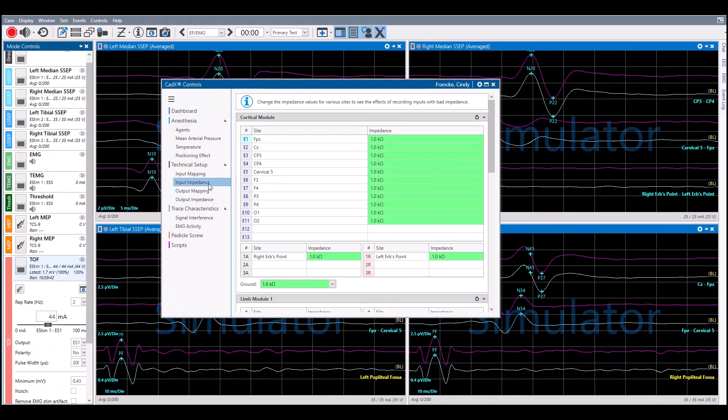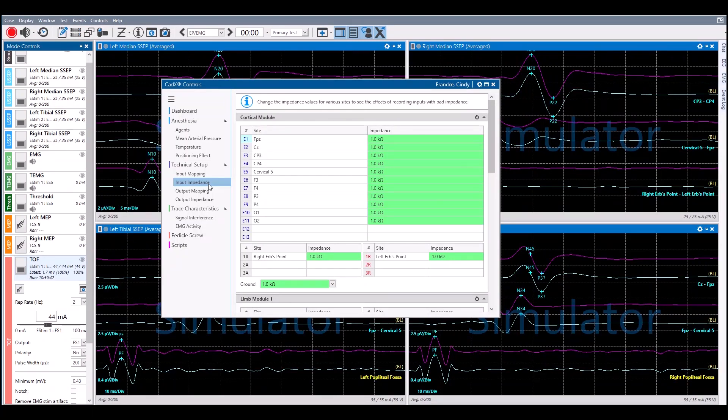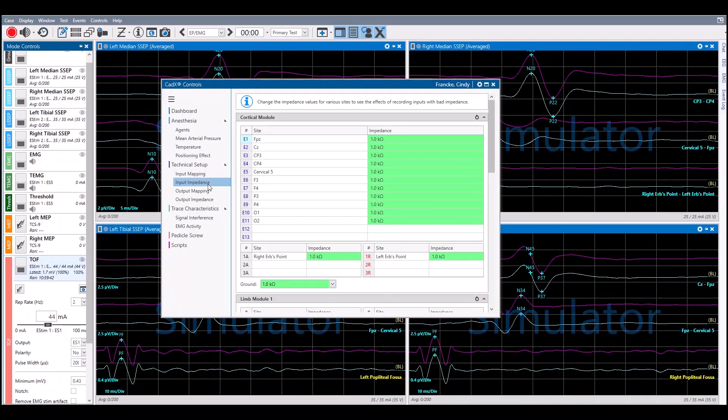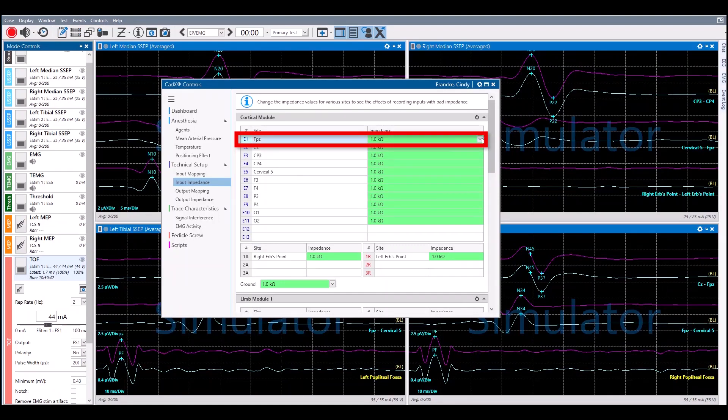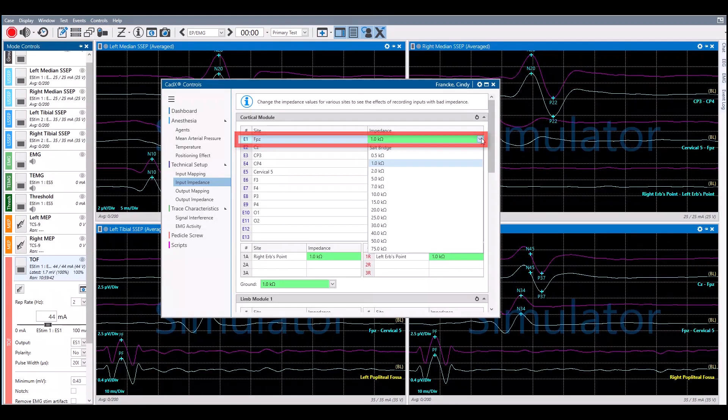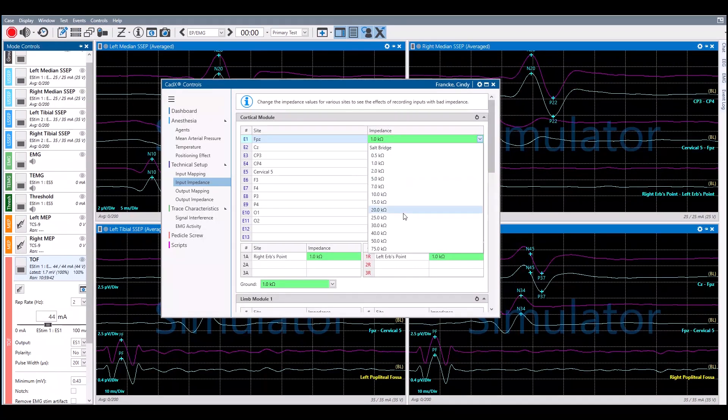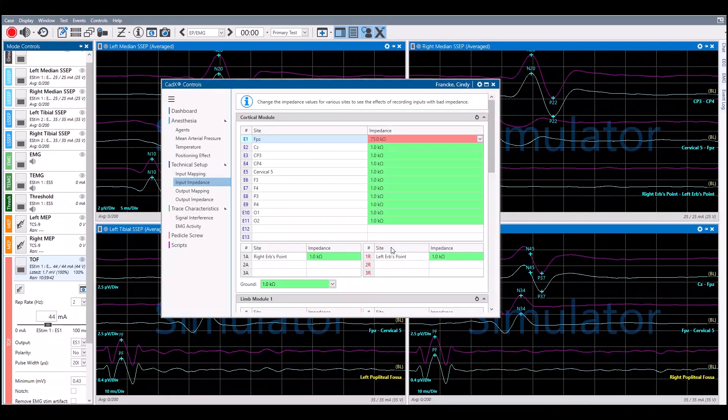Click on the electrode that changes are to be made for and choose an impedance value. The default impedance is 1 kOhm. In this scenario, FPZ has been given a high impedance.